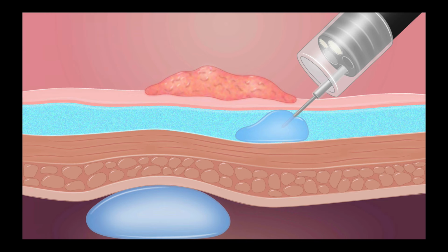Instead, gently withdraw the needle, and as you withdraw, ask your assistant to tap small aliquots of fluid so that as the needle comes into the submucosa, it finds itself a nice place to create a submucosal bulge.